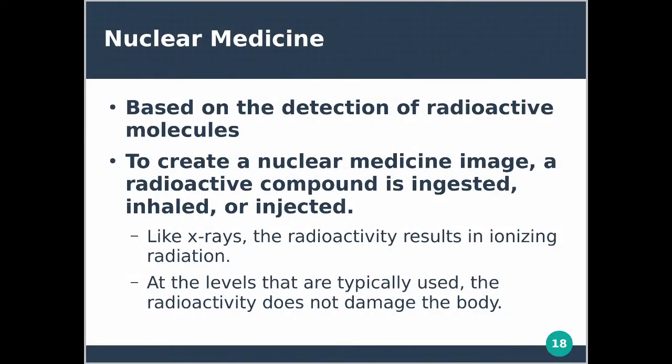Now, nuclear medicine is based on detecting radioactive molecules. It was a bit controversial when it started because it uses radioactive molecules, and we know that radioactivity can be harmful to tissues. However, in this technique, we are using those radioactive molecules in just a small amount, such that they won't pose a significant threat.